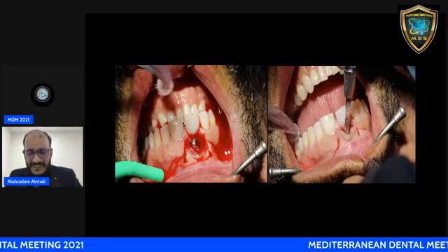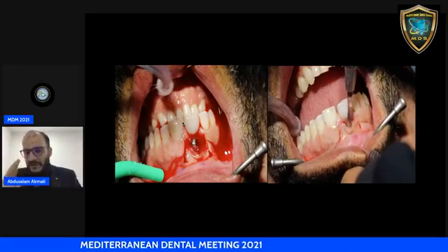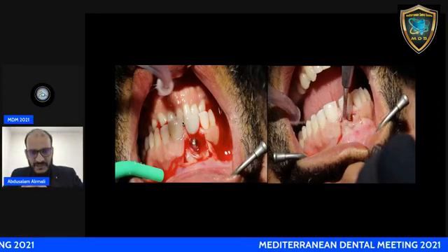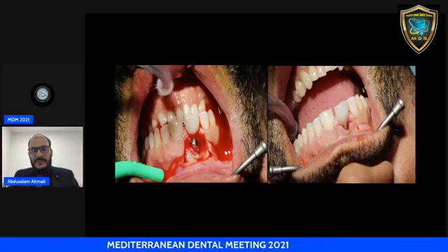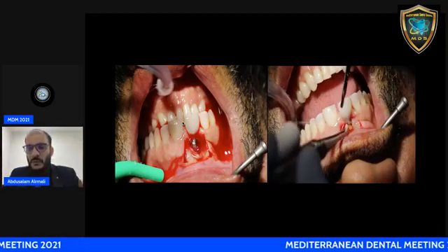So split thickness, no periosteal elevator, all split thickness even over the implant. Try to keep the attachment over the implant threads. Try to do a deep split and a superficial split to be able to move your flap in a coronal direction passively without any tension.